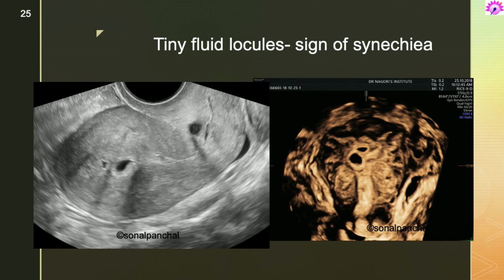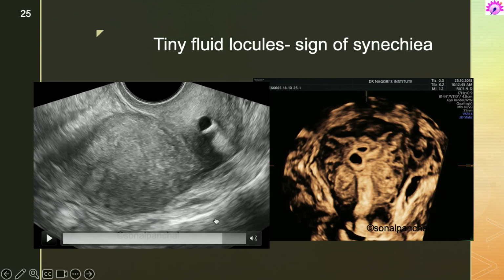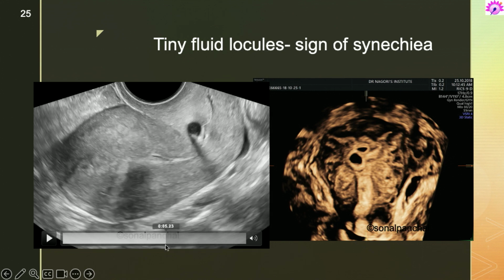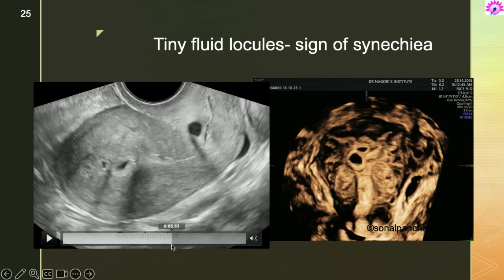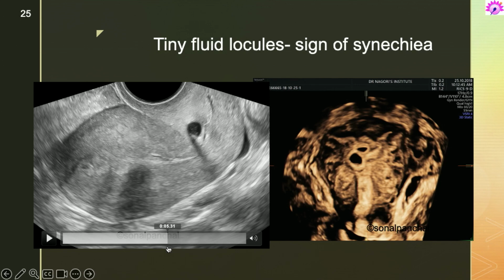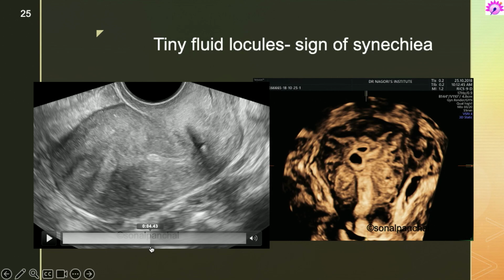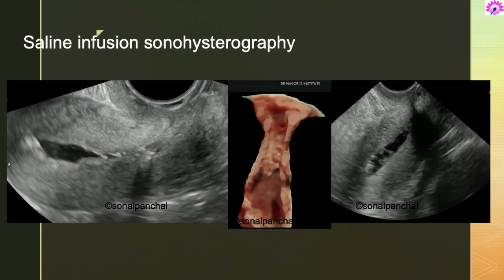And so first one is the upper one. I would stop here and show you, because you have a question. In fact, let me see it more closely. Probably both of these are Nabothian cysts, and they are not niche or anything. So, moreover, you may also, so it is sonohysto.